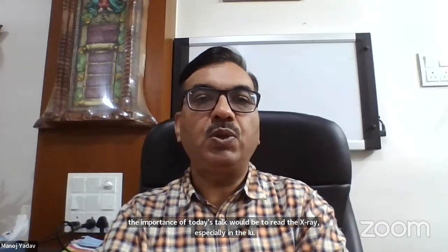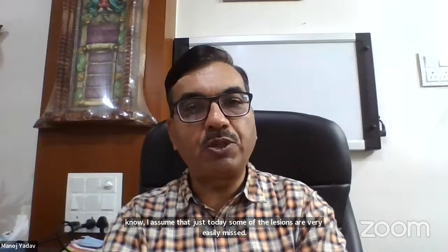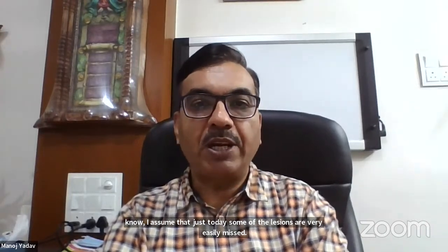Yeah, very good. I wanted to hear that only. So the importance of today's talk would be to read the X-ray, especially in the ICU, where you go to give physiotherapy. In an ICU chest X-ray, some of the lesions are very easily missed: small pneumothorax, small effusion, a misplaced endotracheal tube, a misplaced Ryle's tube. These are easily missed.